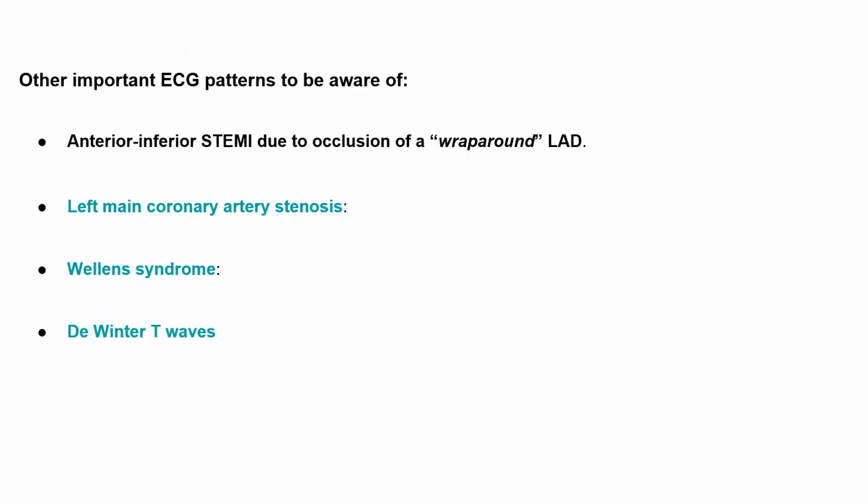Now, other important ECG patterns you should be aware of. Among these, I have already discussed Wellen syndrome and De Winter T waves. These are seen in acute LAD occlusion. I'll not be discussing in detail again. You have to see the previous lectures.